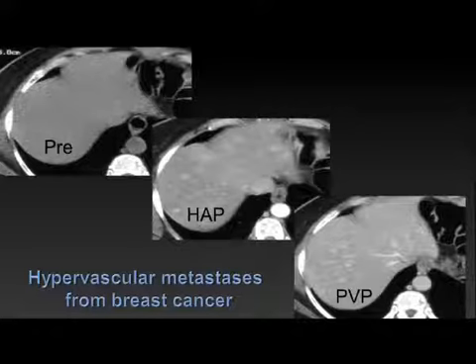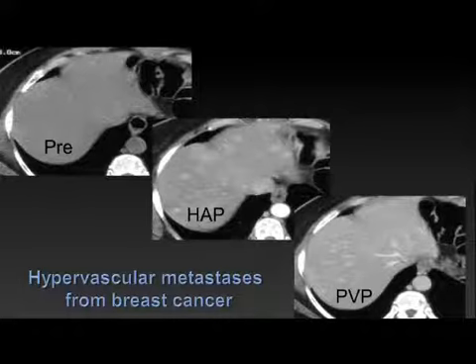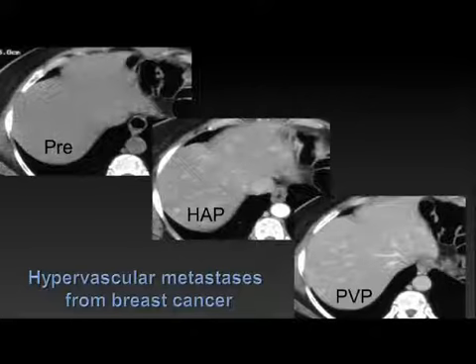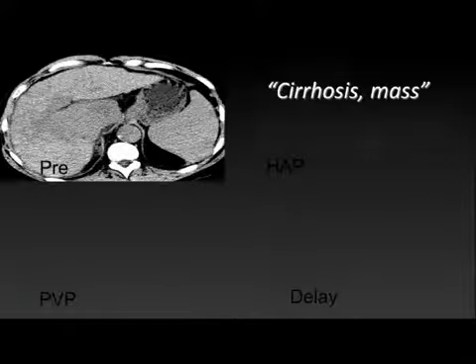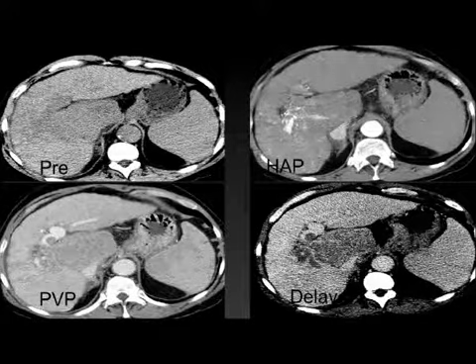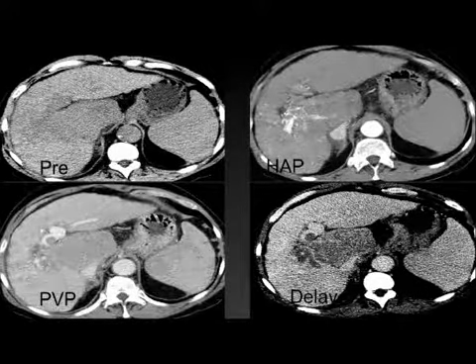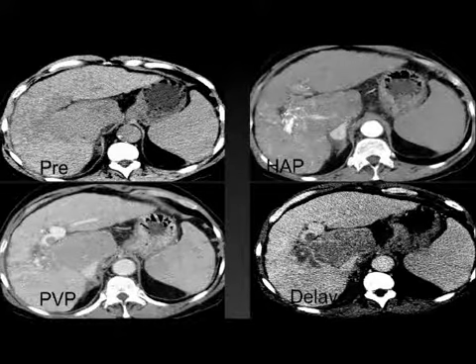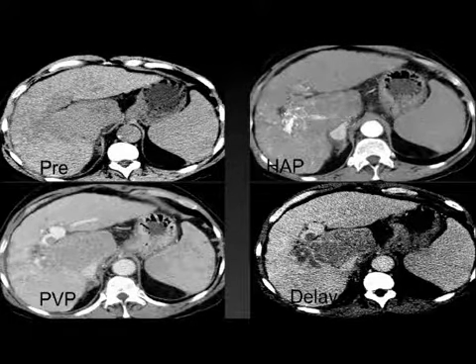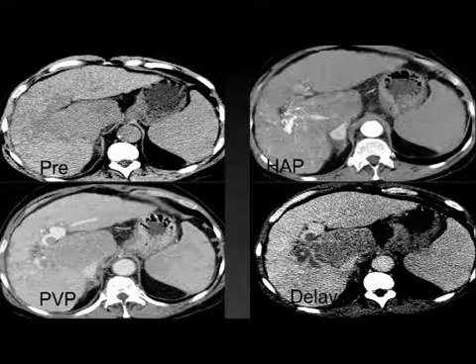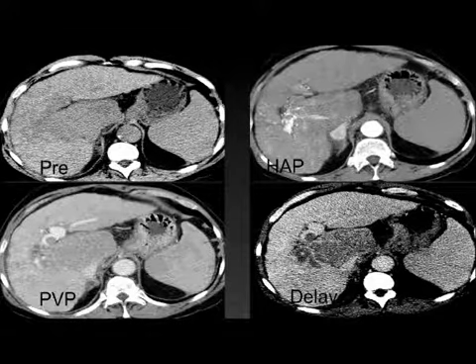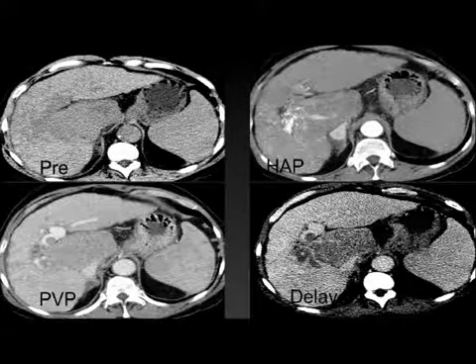We need to be very careful about which phases we choose and which we exclude. Based on that data, the group decided to eliminate the pre-contrast phase in patients with breast cancer. I can tell you at my current practice, the group feels strongly that pre-contrast scans through the liver are absolutely critical in a cancer care center. This patient also has a four-phase scan — hepatocellular carcinoma growing into the portal vein — and we need to ask ourselves if we really need four CT scans of the liver to make that diagnosis.